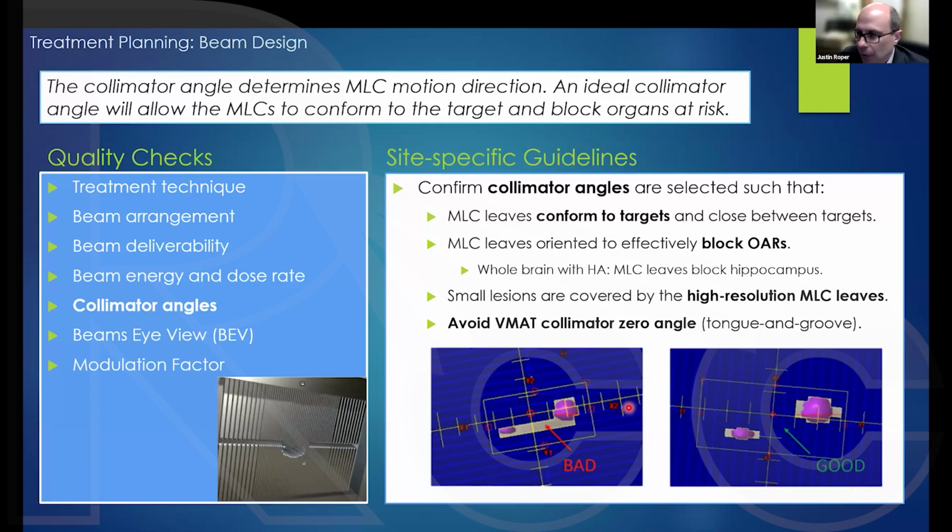Hey, we tend to track it at Emory, but usually okay. We're achieving target coverage first, right? So we're not compromising on that based on hippocampal dose. And we're leveraging the fact that there are many non-coplanar beams and strategic optimization objectives that achieve a very sharp dose gradient. So I don't know that we're necessarily doing much about it.